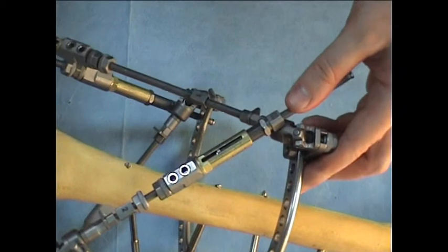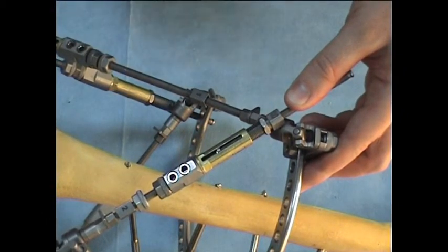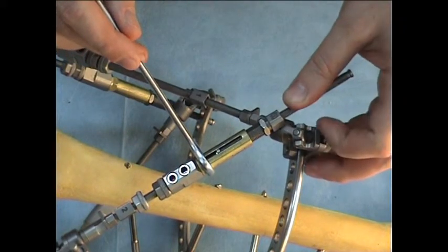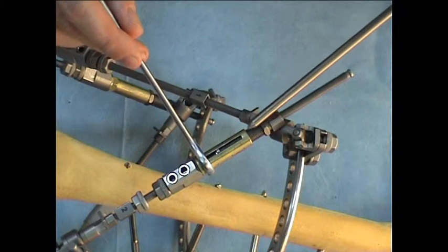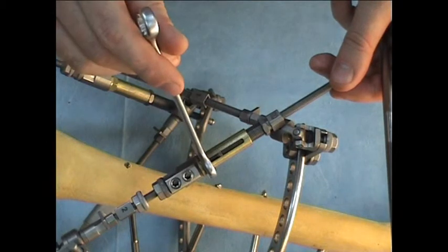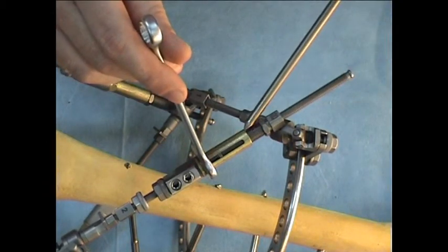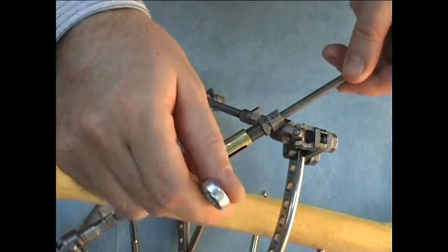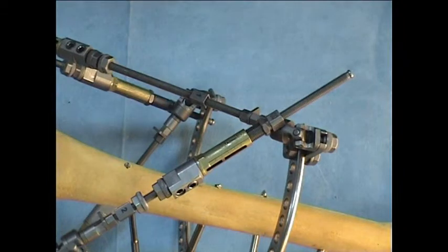So first we turn the strut from one black line to another on the yellow cylinder relative to the bold longitudinal black line of the internal threaded clutch. So you see the first motion is from one black line to another in the plus direction, it is quarter millimeter, and then one more time from one black line to another, it is half millimeter. We have made lengthening of strut number 2.